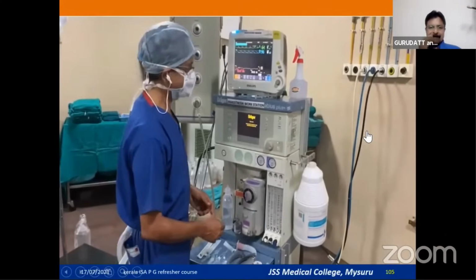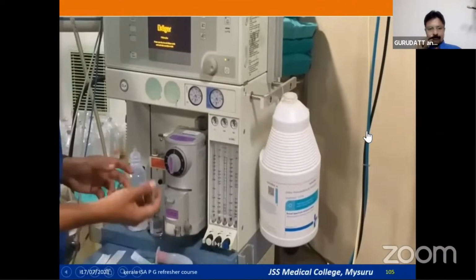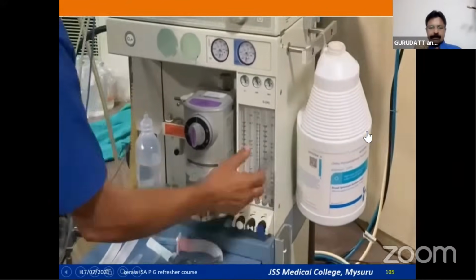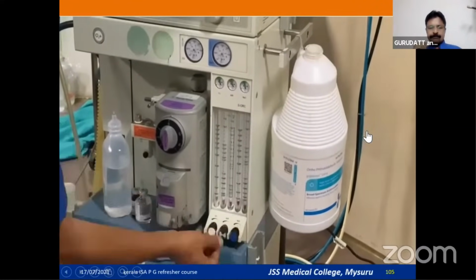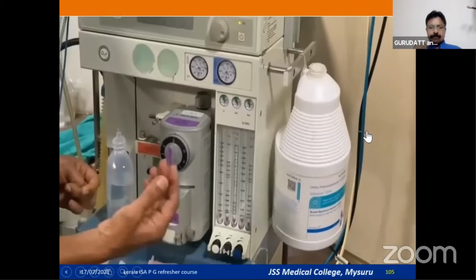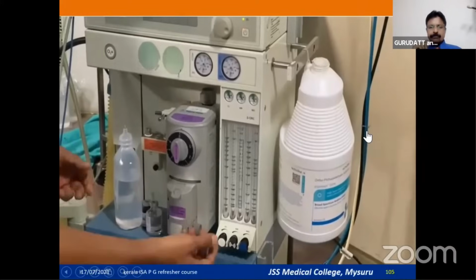pneumatic one. So you just see, now I'm trying to open nitrous oxide, because in Link 25, if I open nitrous oxide, automatically the oxygen flow control knob also would rotate and oxygen also would come out. Now with ORMC or SORC, now I am trying to open nitrous. See, I am rotating the flow control knob of nitrous, oxygen is not moving. Because oxygen has to flow into the nitrous oxide side and then push the piston, then only nitrous oxide gets unlocked and then nitrous oxide can flow.